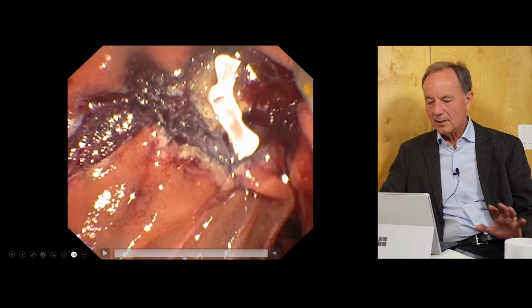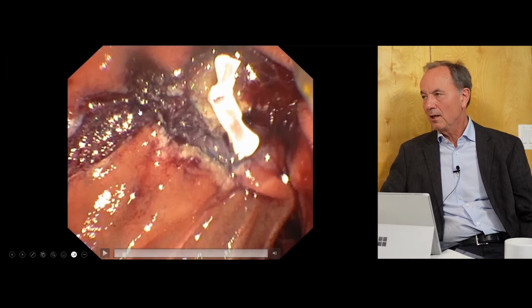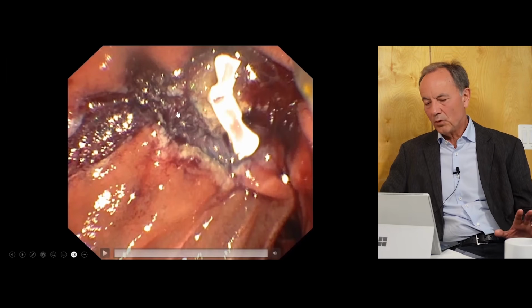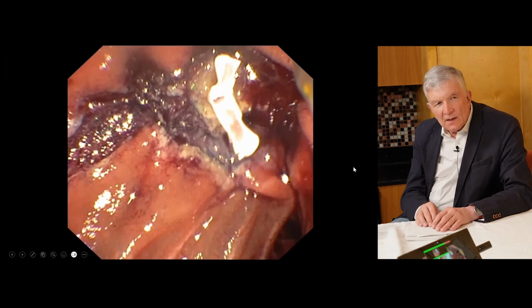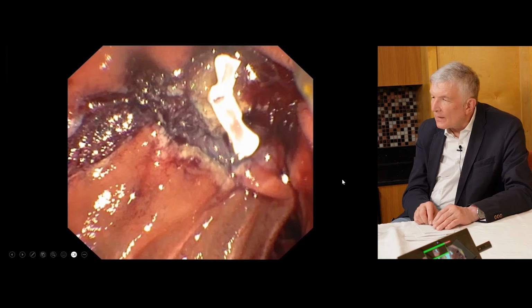So if there is a mild bleeding and we cannot identify the bleeding site, then I would use a hemostatic powder. With electrocoagulation, we should be very careful because of the risk of deeper thermal injury involving the muscle layer. If you consider it, then I would inject first to lift, and then you can burn a little bit. I think that's a very good idea, because you have better visibility, and if you use the blue solution, it's better discernible. So okay, but be very careful. The duodenum is a hysteric organ.